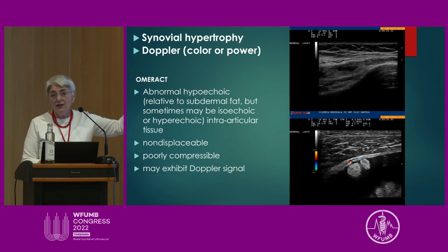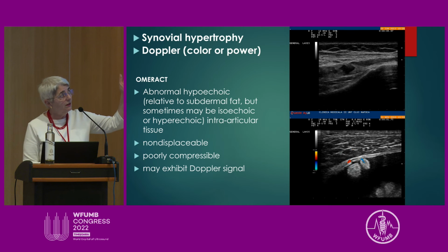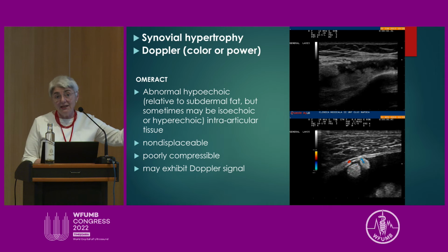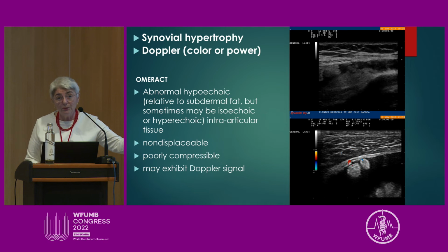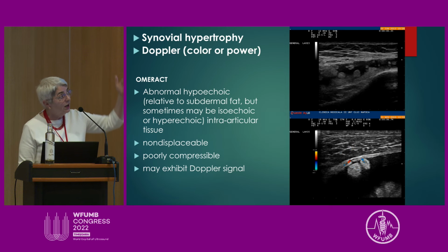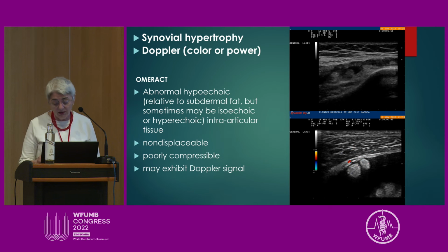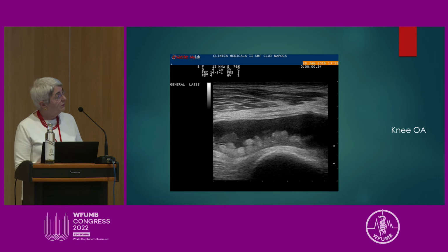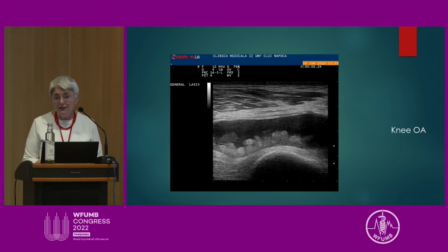You cannot say anything about diagnosis, only see that there is fluid, there is synovial hypertrophy, there is vascularization. You can say, yes, this is an inflammatory process, but nothing about final diagnosis using only this element. So, for example, this case was knee osteoarthritis.